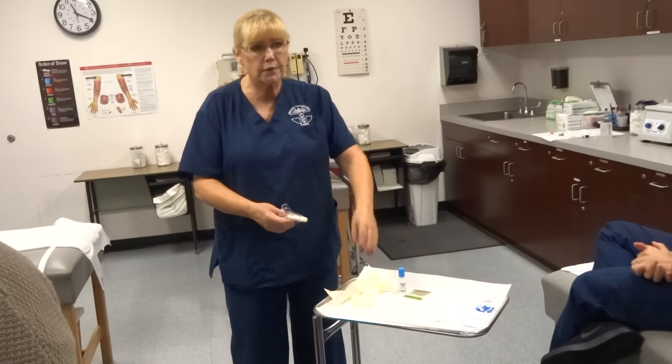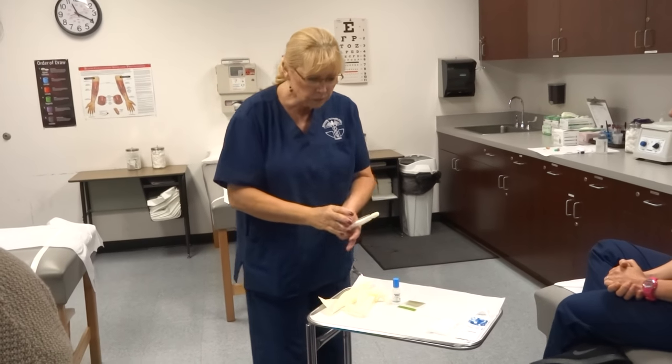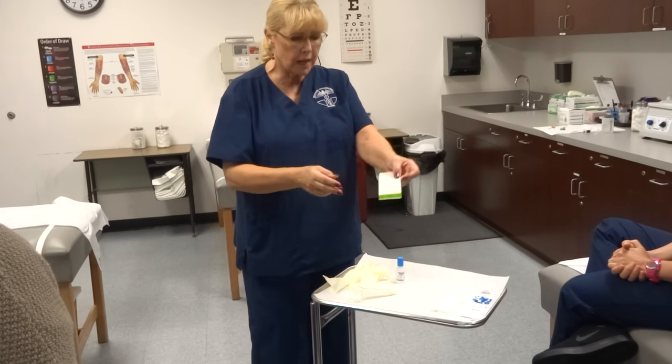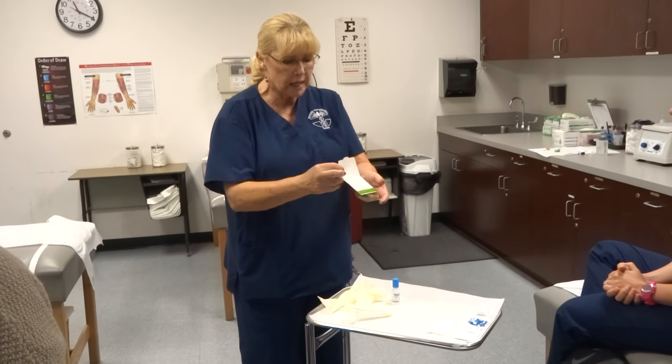So he's going to put two gloves on if he's got to pull the cheeks apart. But if he's just doing a quick prostate exam, that's all he does — feel that prostate and then he's out of there. When he comes out, he'll have just a little bit of stool on his glove. And that's why if you were in the room with him, you would hand him this.